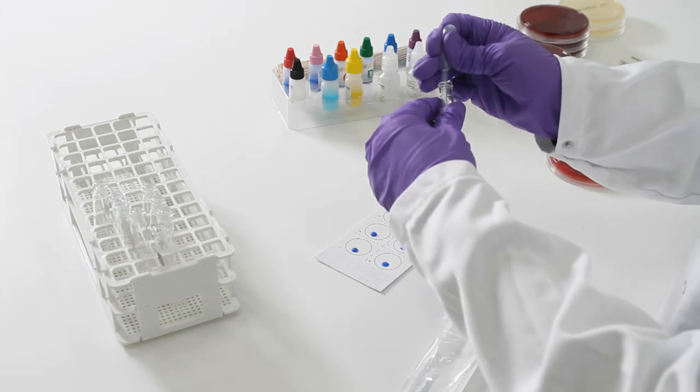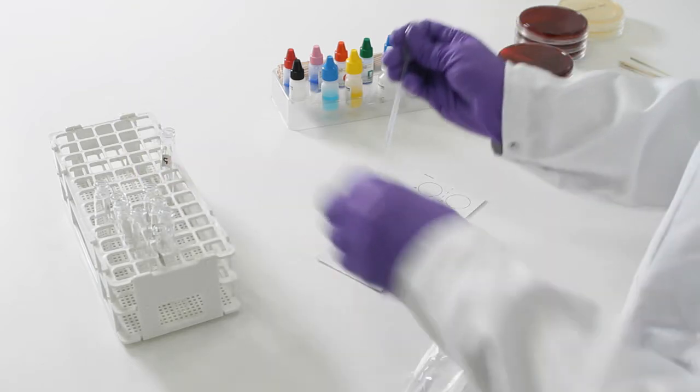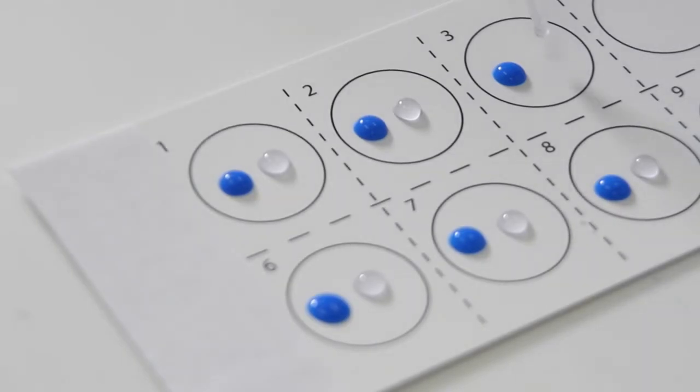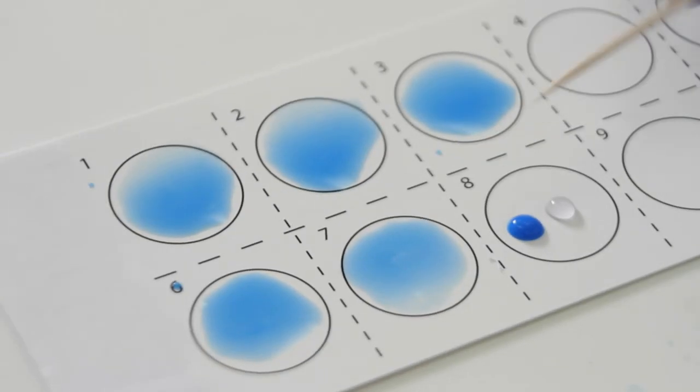Add one drop of each group reagent to separate circles on the reaction card. Then add one drop of extract to each circle. Mix with a stick.